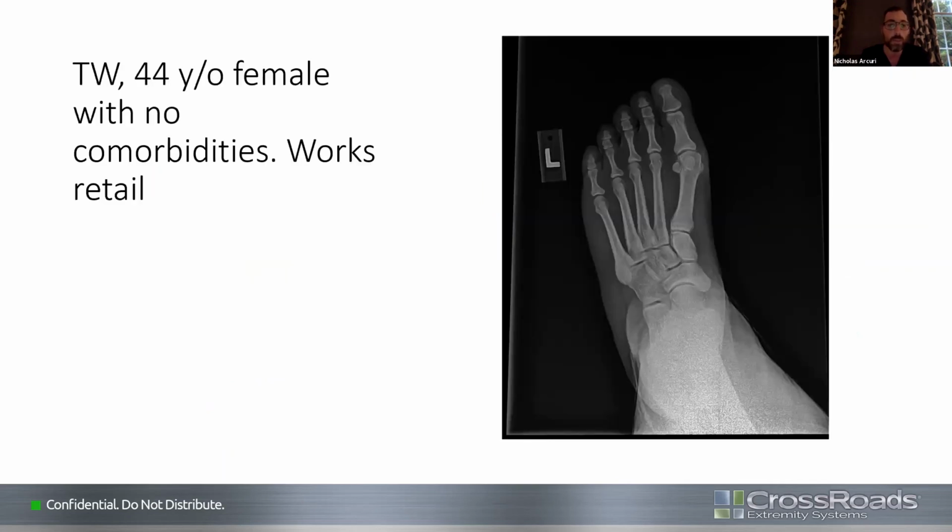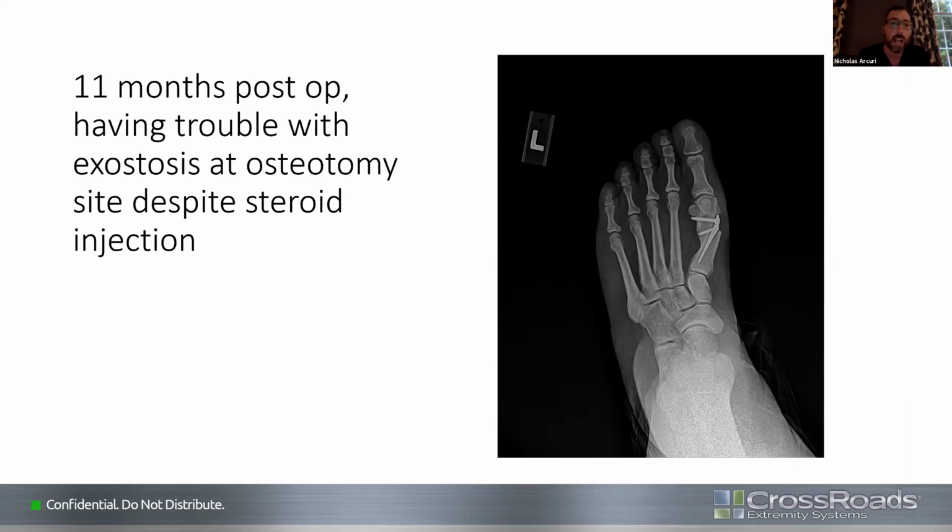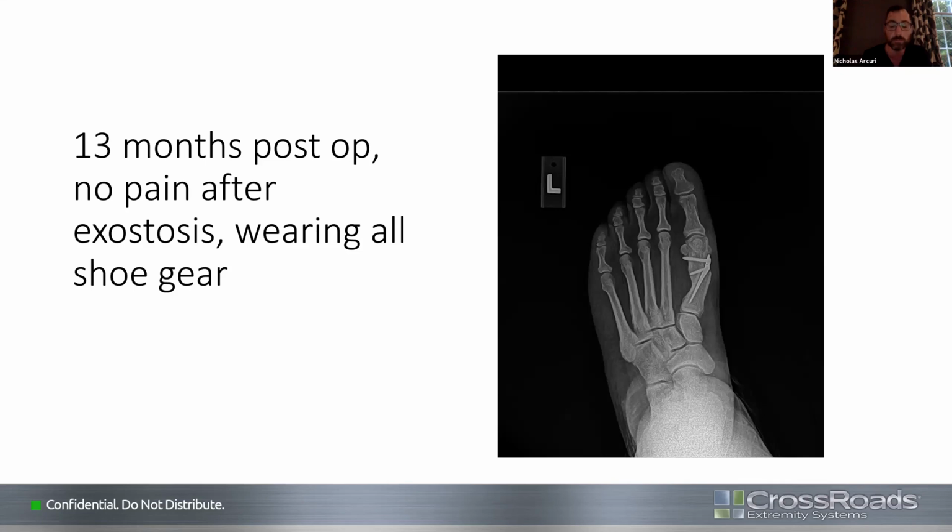I had a 44-year-old female with no comorbidities. She worked retail. She was an excellent candidate for the mini bunion procedure. She went through the surgery without any complications. At 11 months post-op, she started having some trouble with the exostosis. Dr. Lamm went over this a little bit earlier, and he's started shaving that medial osteotomy site where people are having pain. She had a steroid injection, did better, but was still having pain overall. A small exostectomy fixed that very quickly. On all my cases now, I do that to start out with, but this was one of my first. That was one thing we learned, that osteotomy exostosis can happen over time.